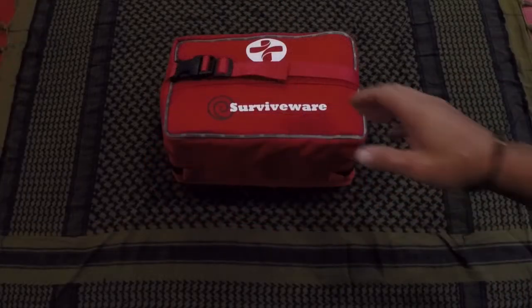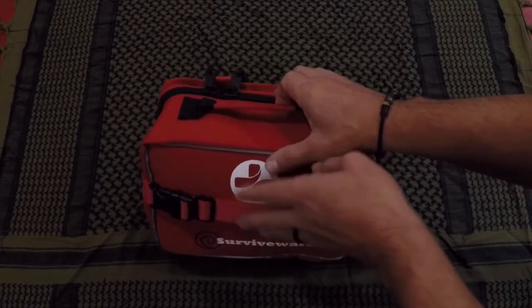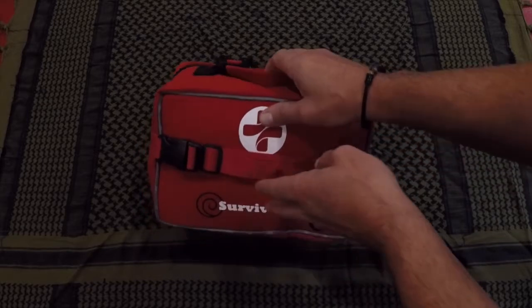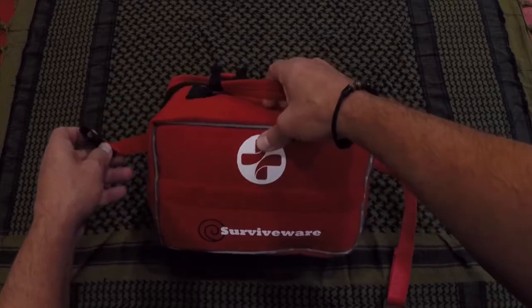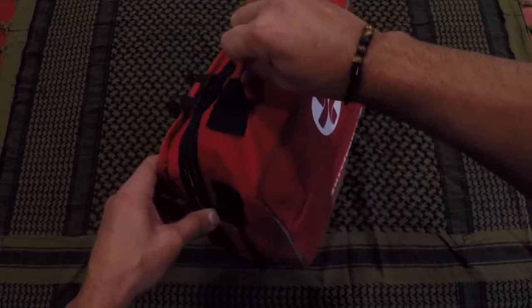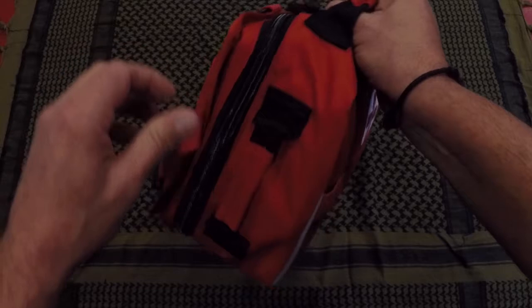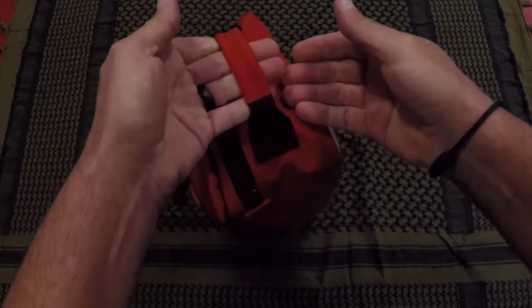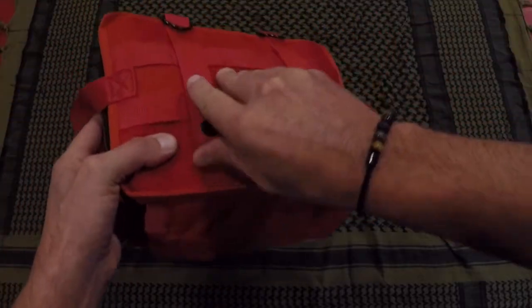The first thing you'll notice about this kit is the actual case — it is really built to last. Water resistant, it's 600D and just built really, really well. All sorts of fasteners to make sure that everything on the inside is retained. There's webbing here to connect to a MOLLE system. The zippers are very strong — not something that feels like you're going to use it a couple times and it's going to fall apart.